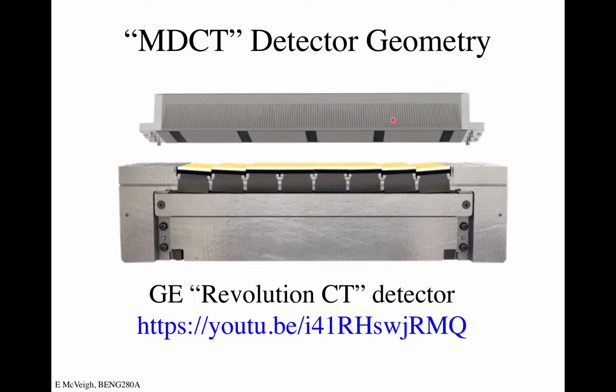This is a very important part of any X-ray imaging detector, and it's the anti-scatter grid. You can imagine, when you put a flashlight on your finger and look at the light that comes through, it's just a glowing red, uniform signal, right? That's because the light is bouncing off everything.